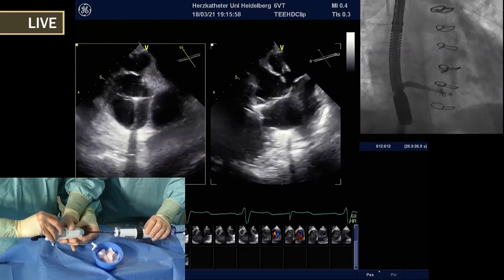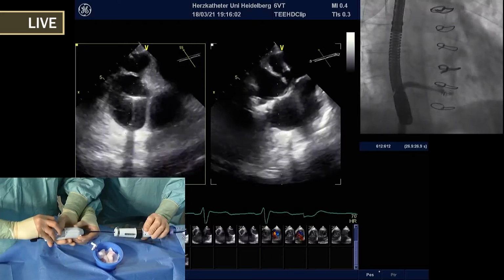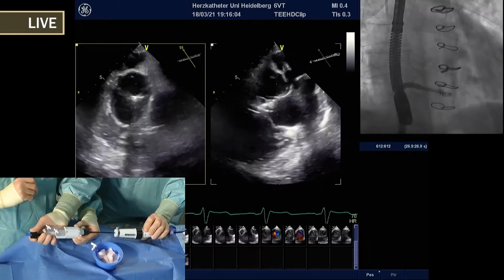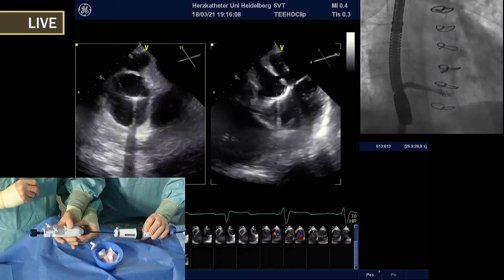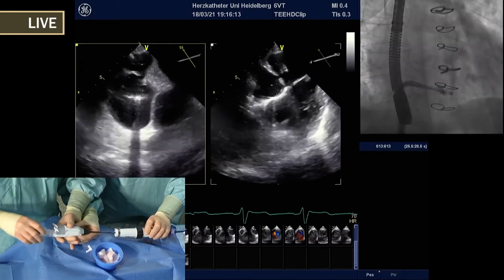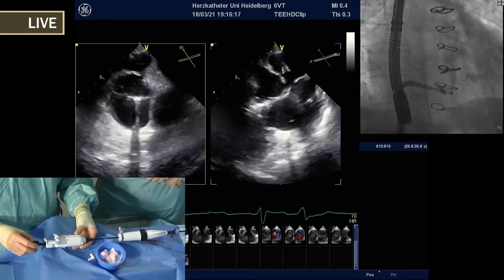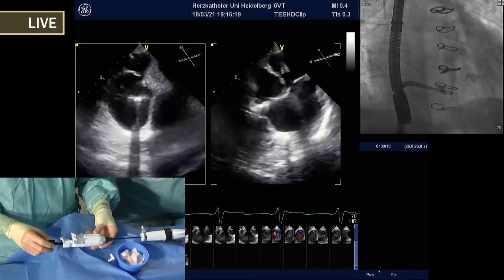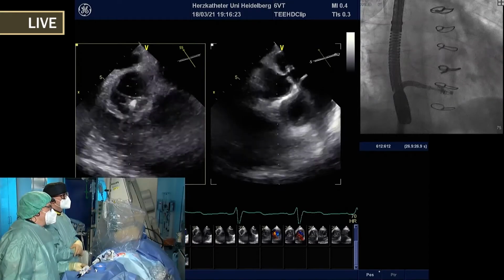We open the anterior. Yeah, so this is separate grasping now and optimization. That's a nice demonstration. You can see that this goes quite nicely. It's going in. So we close again. Yeah. Okay. So this is leaflet optimization, and you can do that independently on the anterior septal.